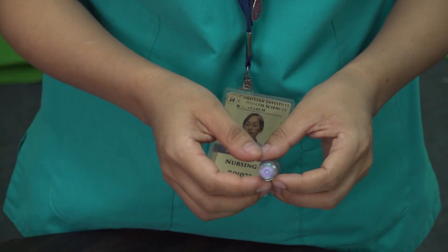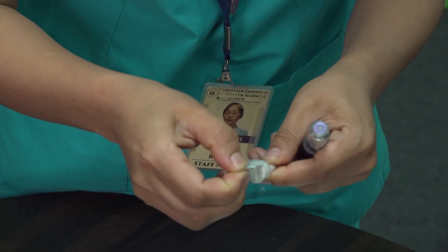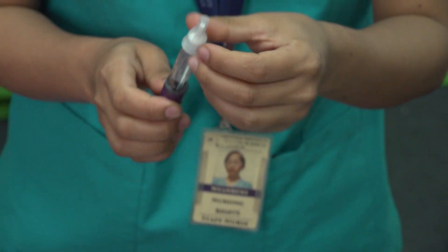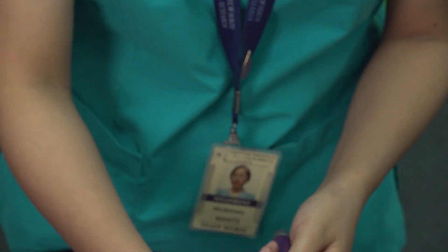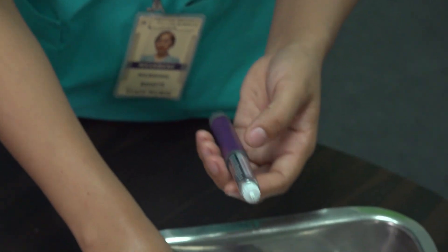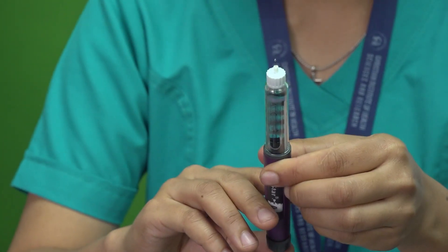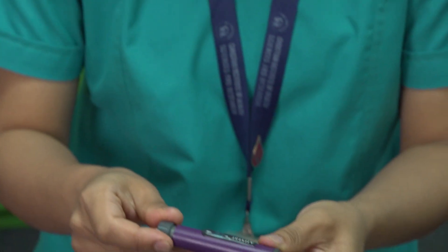Attach the needle by removing the cover and screwing it onto the pen. Prime the pen by removing air bubbles inside it. Dial the prescribed insulin dose as directed.